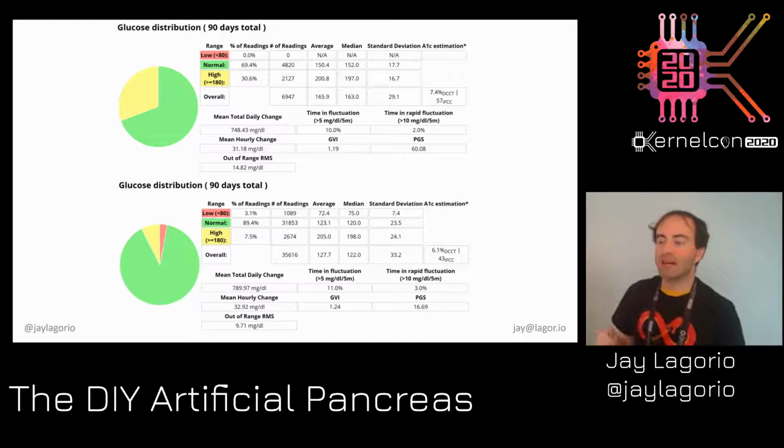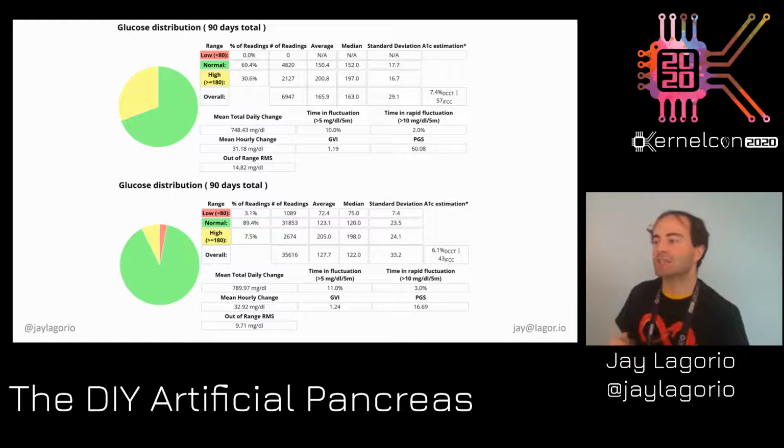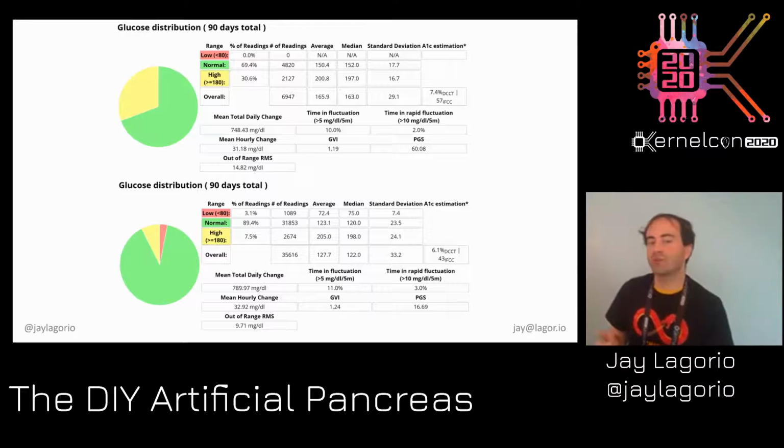So down below, June to August of 2019, this is with OpenAPS, the latest versions. Normal was 89.4, almost 90% compliance in normal range. The high was 7.5, so not nearly as much, and it was a relatively lower high. It was right around 200. But again, if your upper ceiling is 180, 181 is considered high. And there was a little bit of low time there, but the low wasn't that low. It was about 70. And for that time, from my own recollection and the data that I kept, there were no serious bottoming outs. And if you look at the A1C estimate there, it's about 6.1. You can barely ask for anything better. And I find these estimates to be off by about 0.2% plus or minus. So this is pretty good.